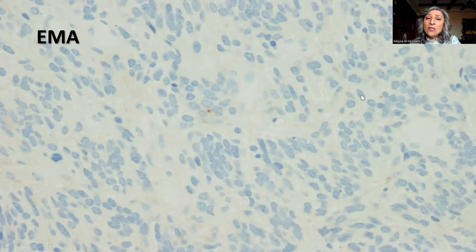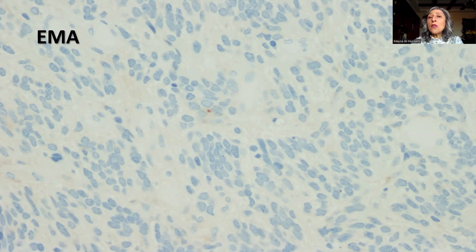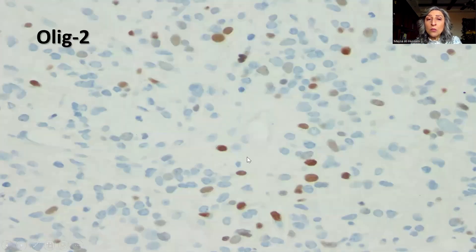In this tumor, only scattered positivity was seen in some of the tumor cells — not the typical positivity that we would expect in ependymoma.